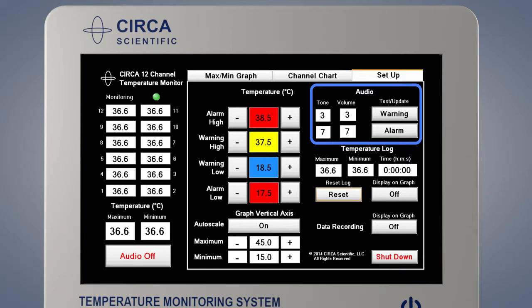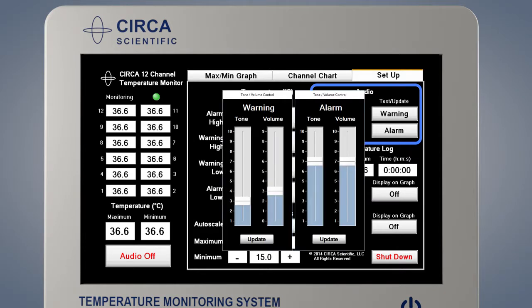To adjust the volume of the warning and the alarm, press either the warning button or the alarm button. A pop-up slider will appear. Drag either the volume or the tone with your finger. When the setting is at the desired level, press Update. Please note, the warning volume may be set to zero and then it will be silent. The alarm volume must always be higher than the warning volume and cannot be set to zero.